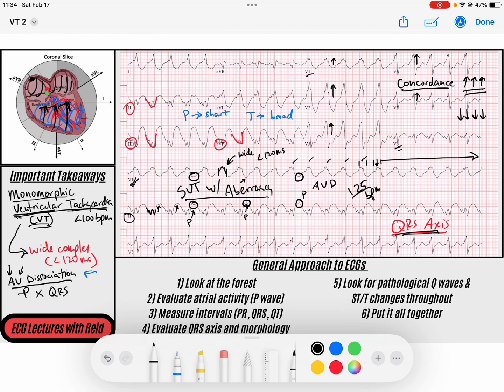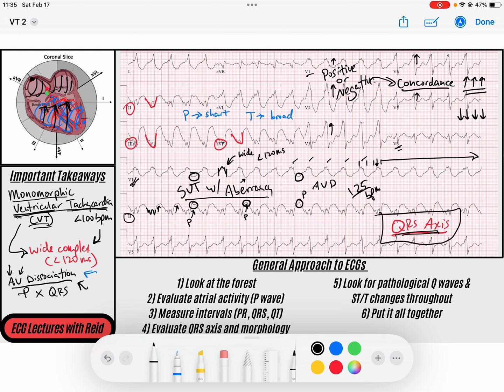So our features of VTAC, especially monomorphic VTAC: we're going to have a wide complex rhythm; we're going to have AV dissociation because the atria and ventricles aren't communicating; we'll potentially have positive or negative concordance in the precordial leads; and the axis will sometimes be very deviated — you'll sometimes even see positive forces in AVR.